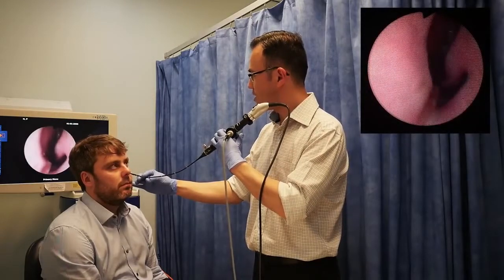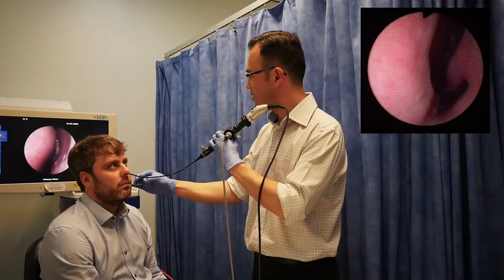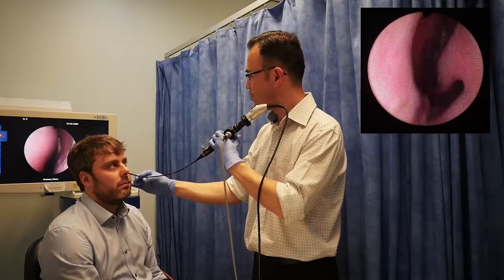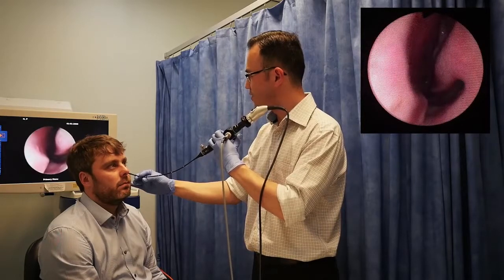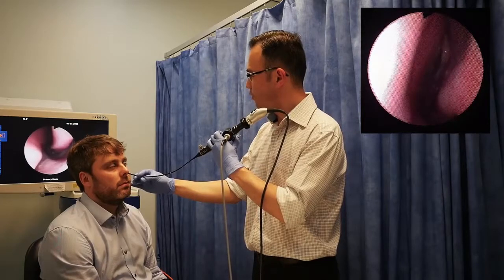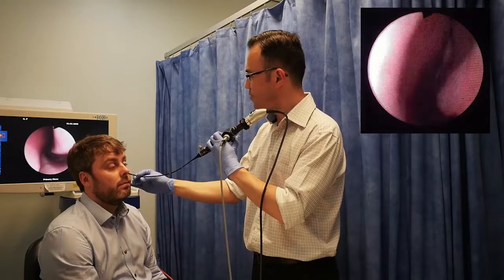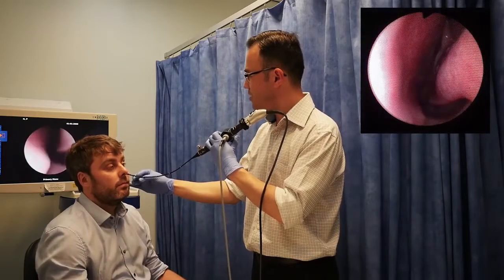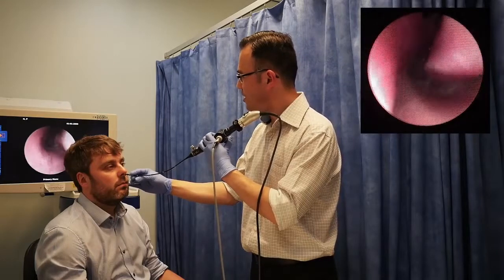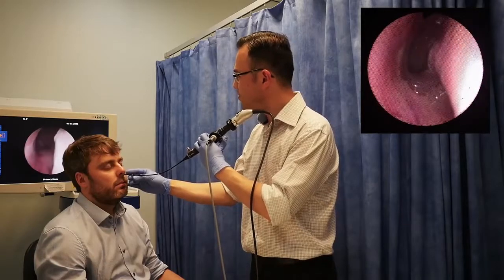And over here, you can see the septum on the left. That's the inferior turbinate there on the right, and the middle turbinate there in the distance. There's just a very slight bend in the septum over there, but it's not restricting our path. The path I would normally take would be along the floor of the nose over here, bounded by both the septum on the left and inferior turbinate just on the upper right. I'm just going to start to pass the scope now along the floor of the nose, all the time keeping the tunnel or the view right in the middle of the scope.